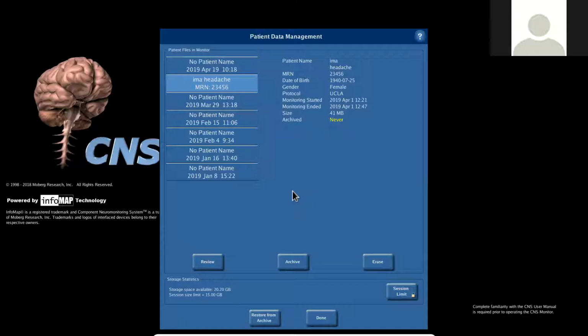And so I think sometimes for training, this is a really nice feature for being able to show the same case. Yeah, that's great. That's awesome. Very good application for that.